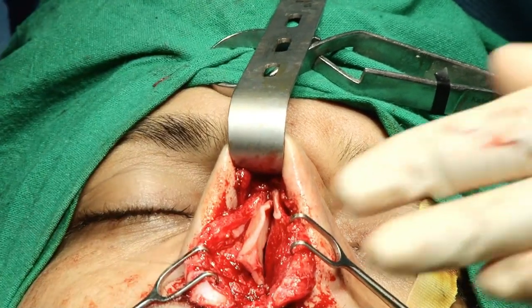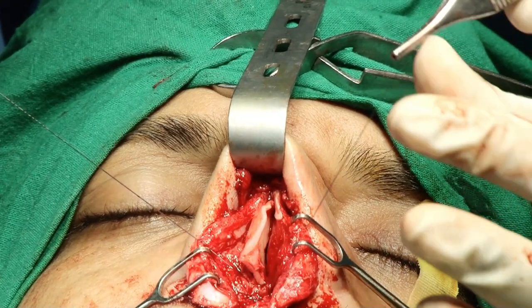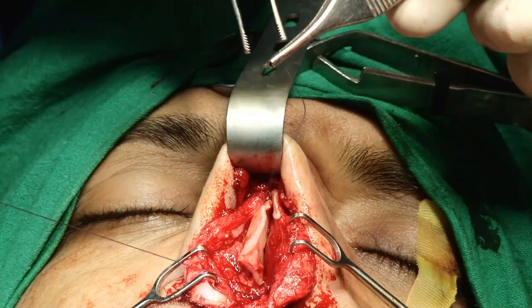Stabilization of the septum is very important. I usually use 4-0 PDS. Some people use 3-0 PDS also.